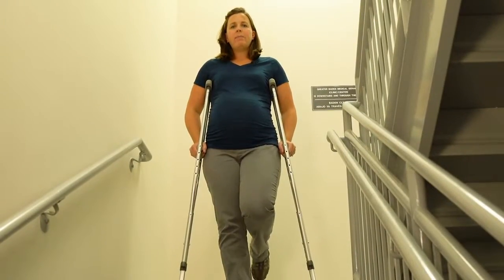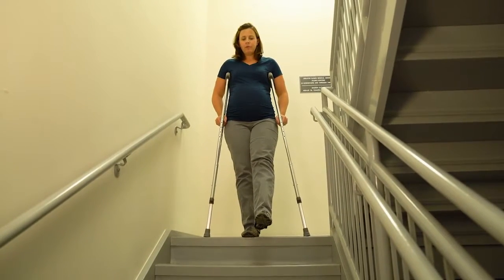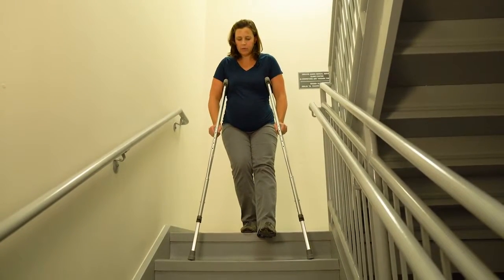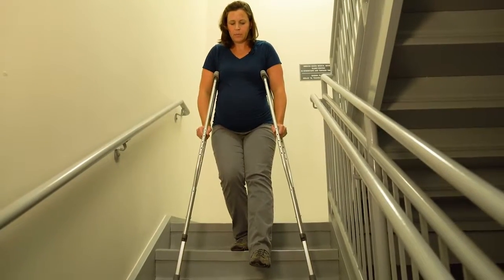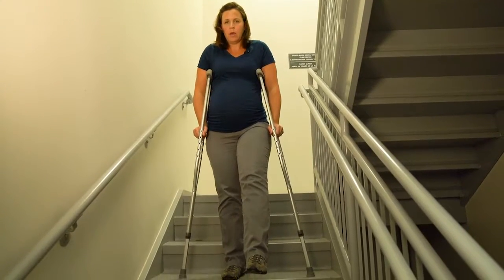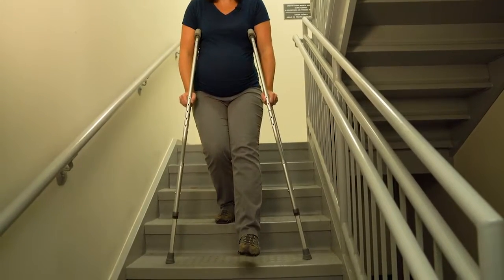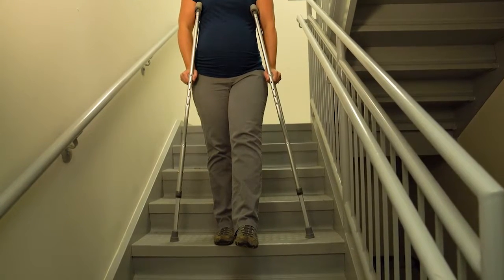If you're non-weight bearing and you have no railings, you're going to put the leg out in front of you, put both crutches down, and then take a nice leg hop. Be sure to have family members nearby if you're not comfortable.